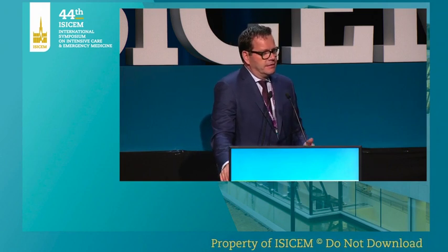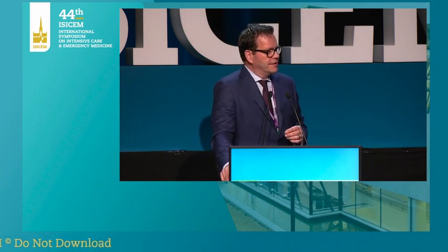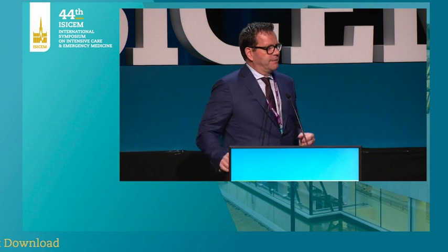I think we should be measuring, and we'll hear more about this later probably, in spontaneously breathing patients, and maybe we don't know exactly what to do about it yet, but I think we should be informing ourselves of how much patients are breathing, how much effort they are making, how much pressure they are generating, which we're generally blind to on the ventilator unless we make some special maneuvers. And then in individual patients, do we put in esophageal pressure?